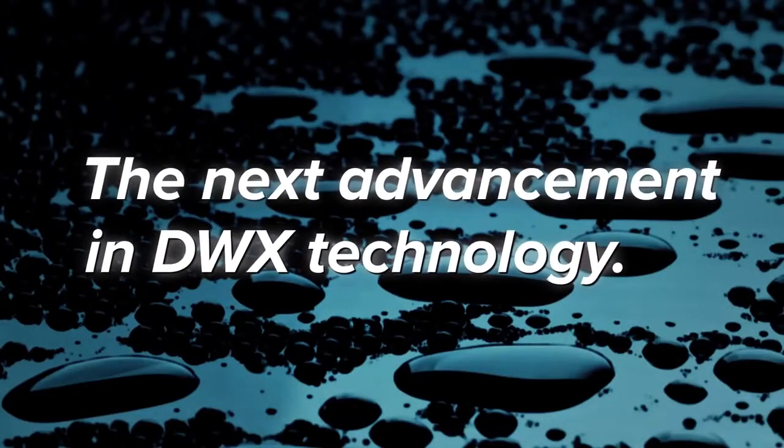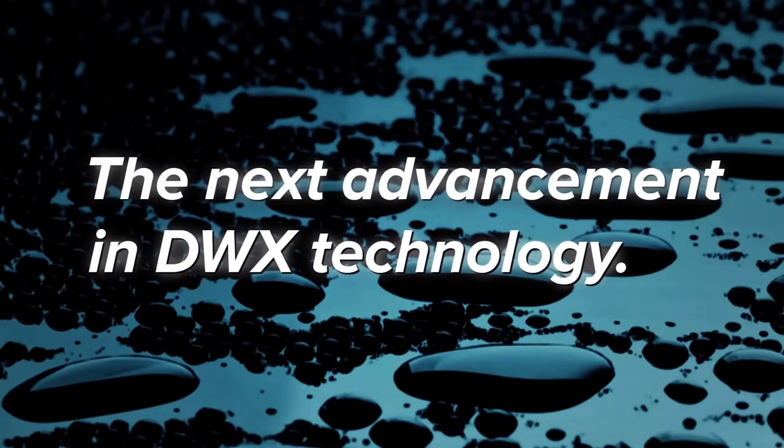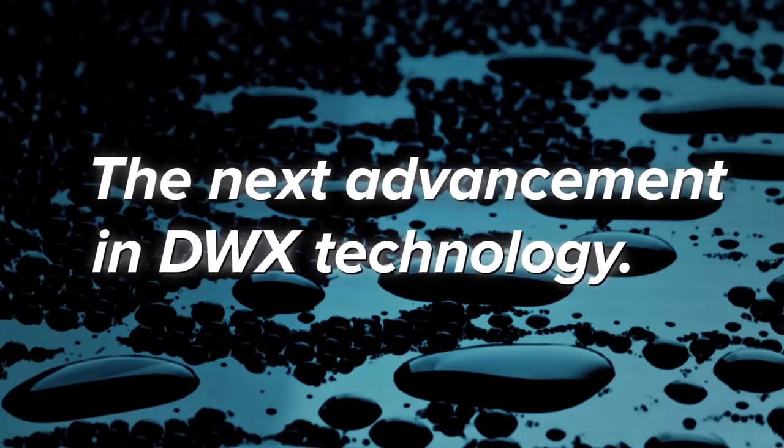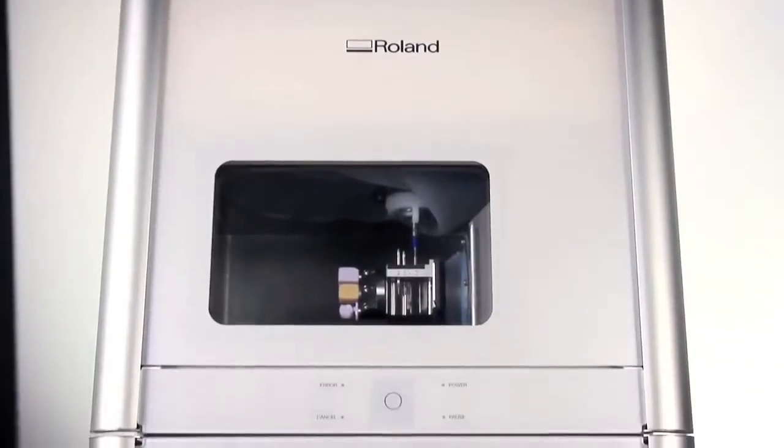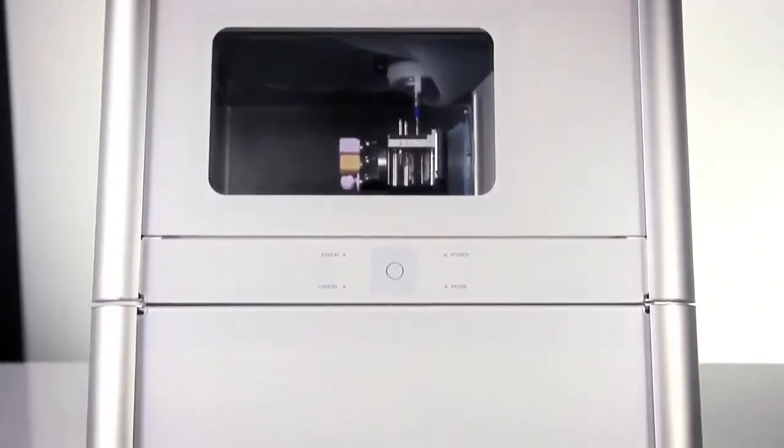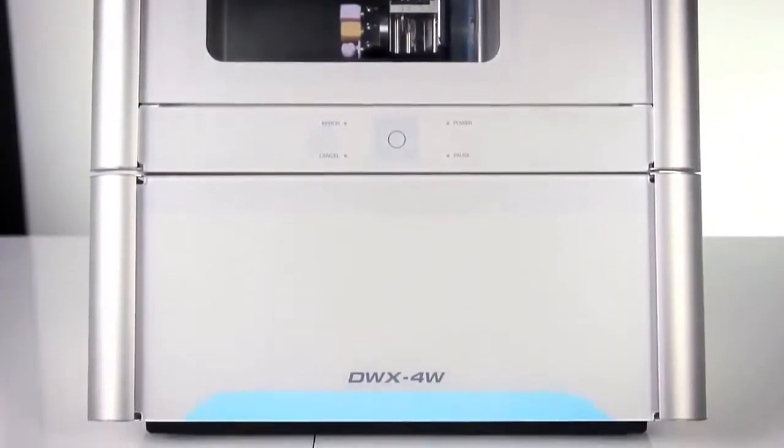Now, Roland introduces the next advancement in DWX technology, the DWX-4W wet dental mill.